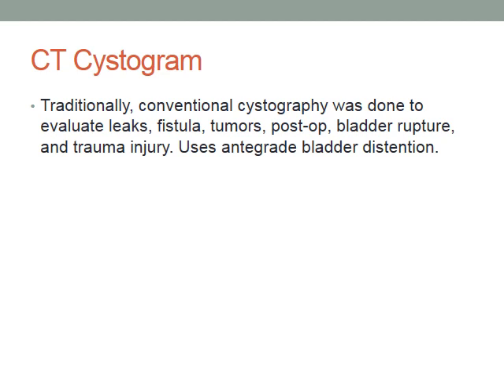Traditionally, conventional cystography was done to evaluate the bladder. Conventional cystography is used to diagnose and evaluate bladder rupture, leaks, fistula, post-op surgery, and traumatic injury. It is considered the standard reference study for evaluating these bladder diseases.